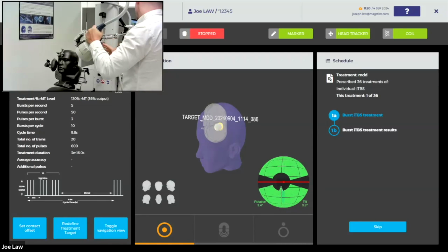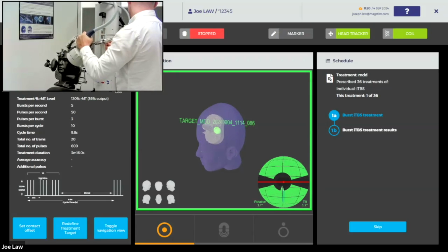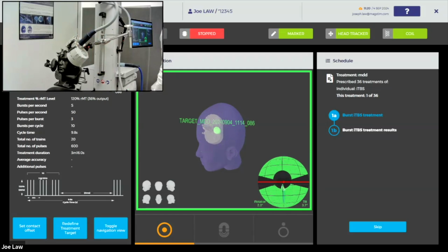So now I've got my orientation correct. I just need to place the coil in the right location, which is on that yellow cylinder. So if I take the coil to the patient's head and place it on that location, you notice the entire thing goes green. Again, if I move the coil out the way, I lose that location. I can bring it back in and I'm back within tolerance. So at this stage, we would lock the coil up in position, let go of the coil, and now it still remains green, so I'm able to treat. That's telling me all parameters are within tolerance.